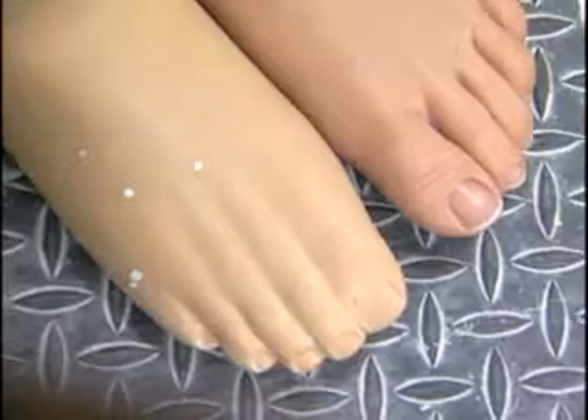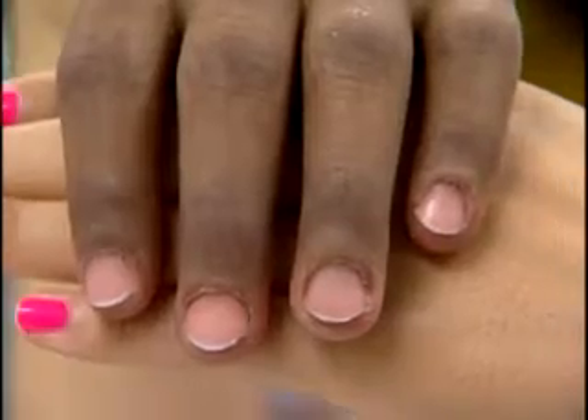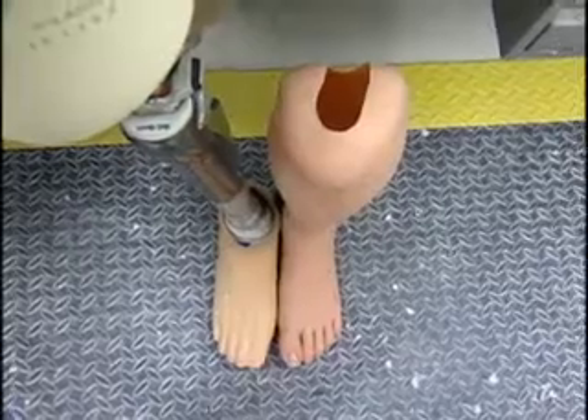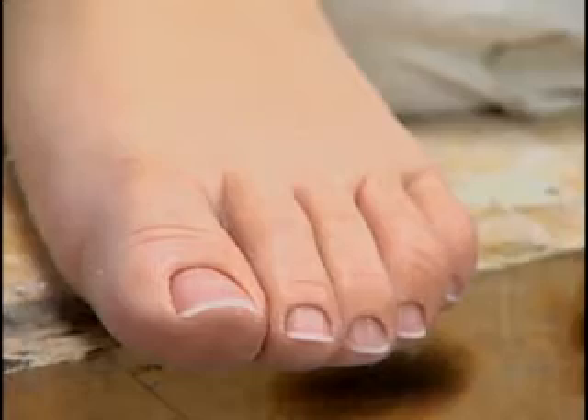Today's prosthetics don't have to look like cold, robotic limbs. Silicone skin gives artificial limbs a startling resemblance to the real thing. Creating life-like parts requires a meticulous artist who captures every detail, right down to the toenail.